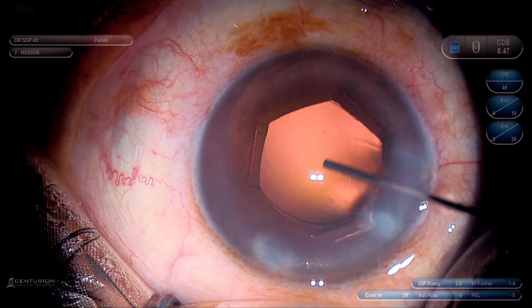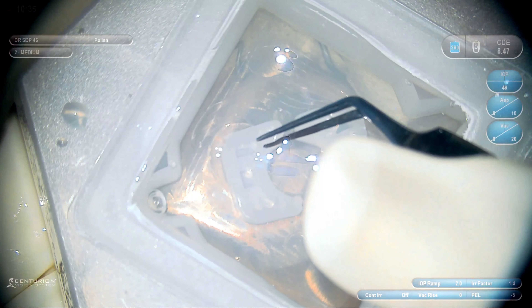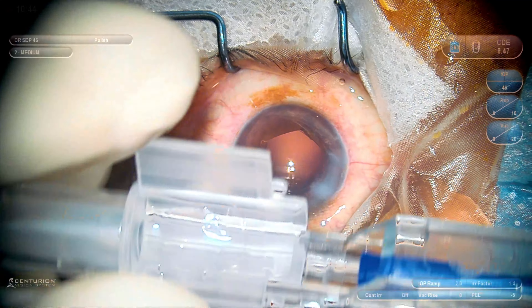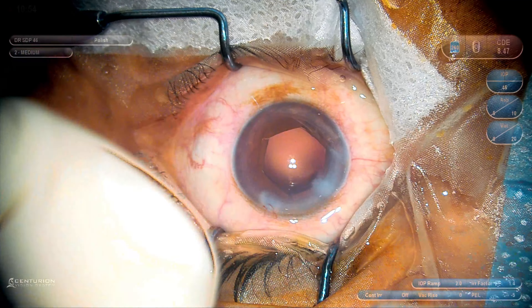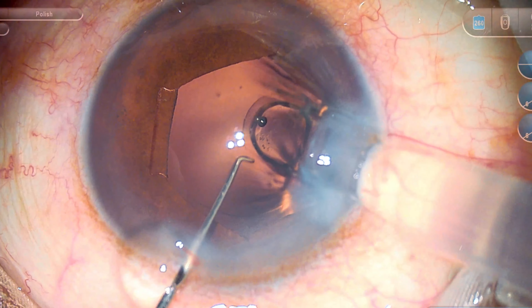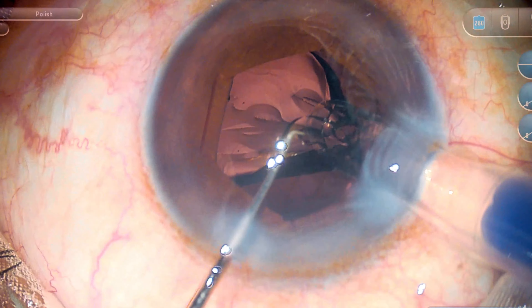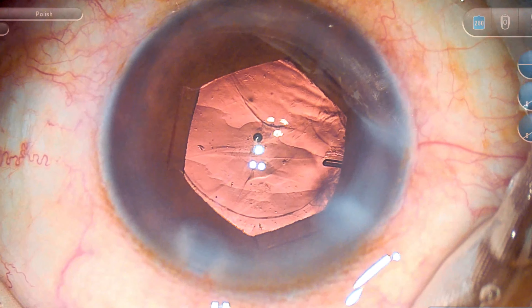This is the Lucidis IOL, which comes in a water bath. It is a hydrophilic IOL with a hydrophobic modified surface, and its haptics are like larger plate haptics with bigger holes in between. Here I push the injector right inside the eye — which I generally don't do — but I want to make sure that the trailing haptic is directly delivered into the bag rather than the anterior chamber, so that I don't drag the B-hex ring along with it.